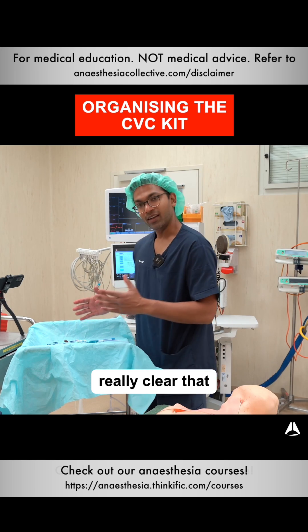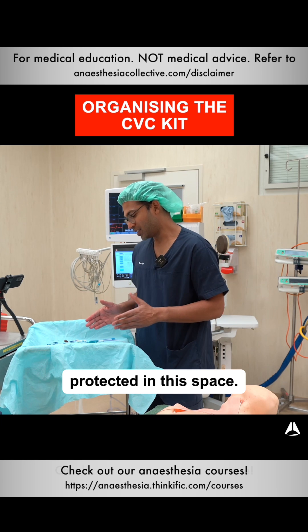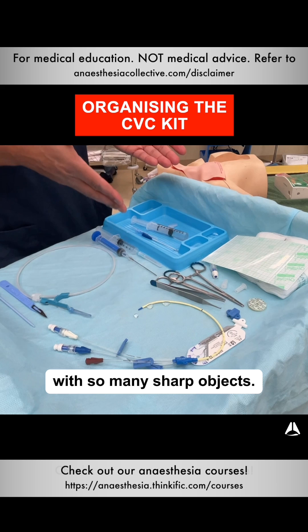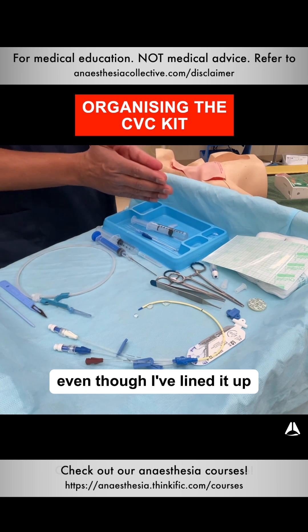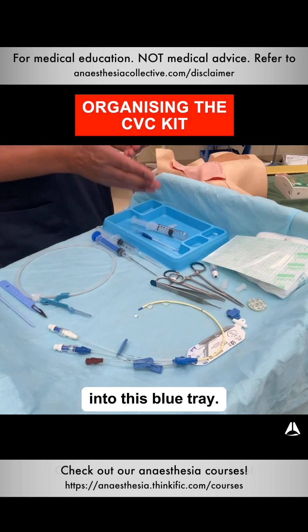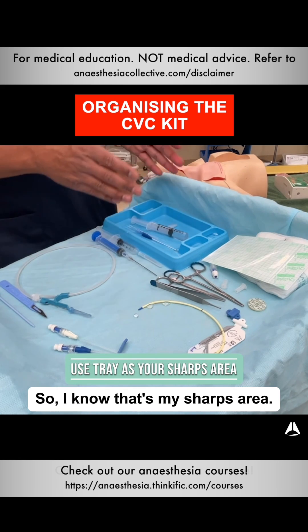I also want to make it really clear that I want to be well protected in this space. It's very easy to get a sharps injury when you're dealing in an emergency situation with so many sharp objects. So generally speaking, even though I've lined everything up like this, once I've used one of the sharp devices, I put it into this blue tray — so I know that's my sharp area.